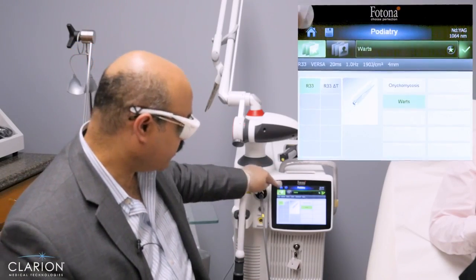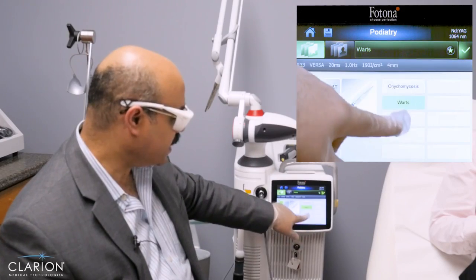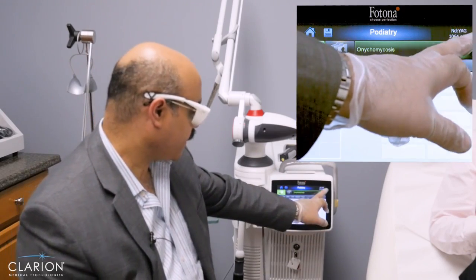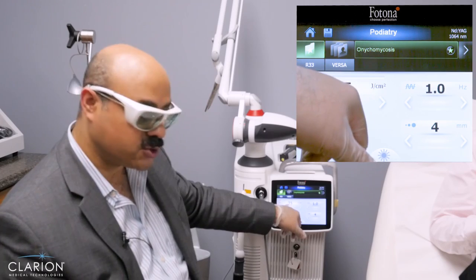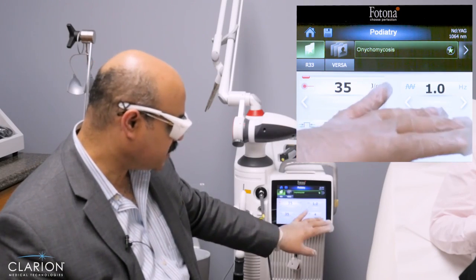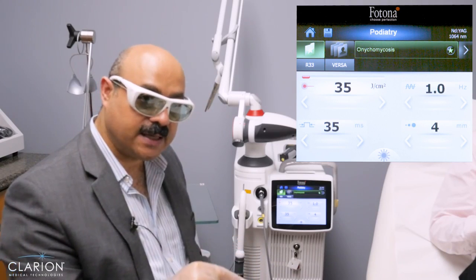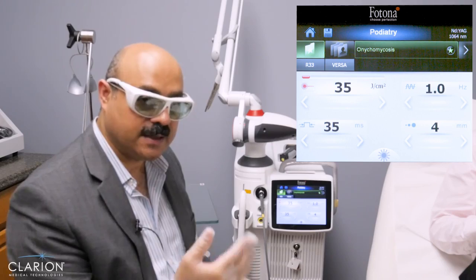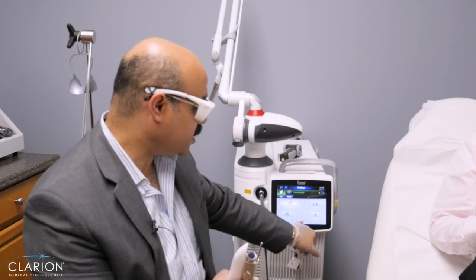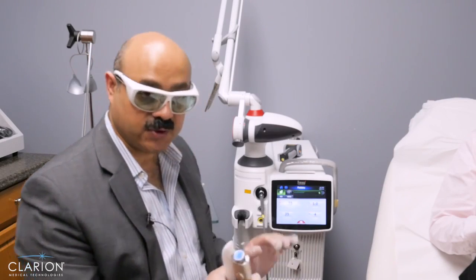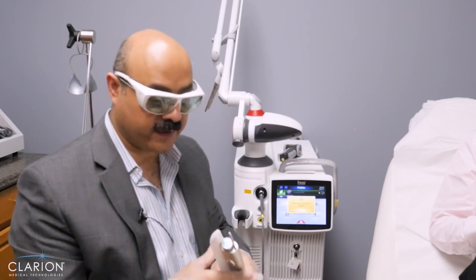For the settings, we go to the Nd:YAG, select podiatry, go to options, and select onychomycosis. For onychomycosis, we use the four-millimeter spot, 35 to 40 joules, 35 to 40 milliseconds, and one hertz. We do three passes on each nail and conduct four sessions at weekly intervals. We will try the treatment without cooling first, and if it is too painful, use a mild cooling level of one or two so as not to decrease treatment efficacy.